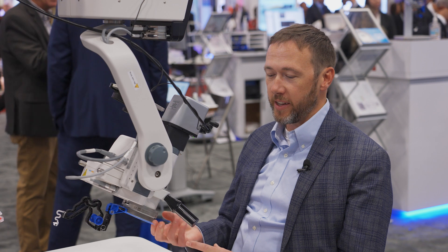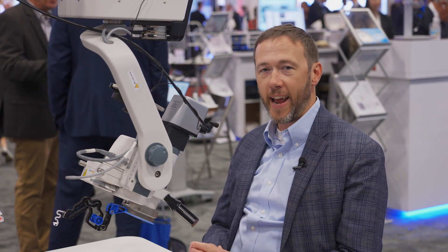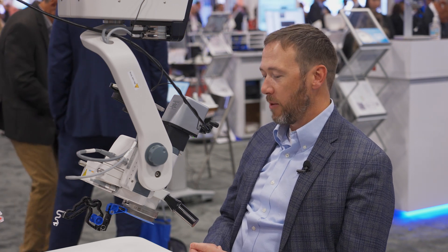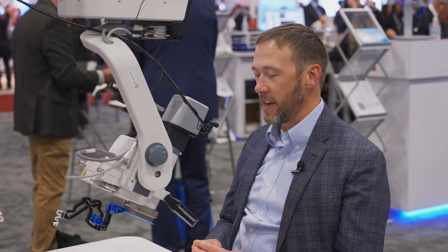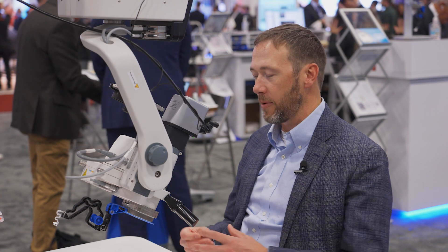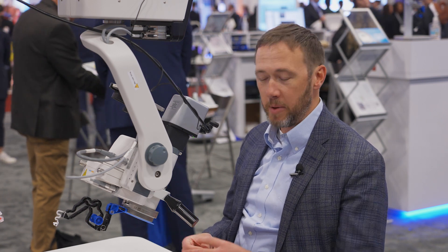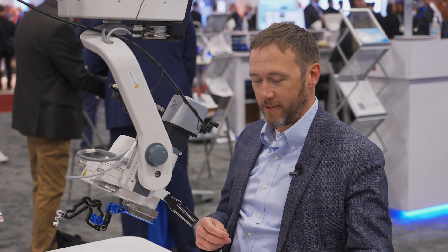Hi, this is Leo Seibold from the University of Colorado. I'm going to be demonstrating the KDB glide procedure using the Oculus surgical gonio ready hands-free gonio prism. We'll demonstrate some of the unique features of the device, take you through a step-by-step use of it, and give you a few pearls on how I'm using it to perform KDB using two hands for the first time.